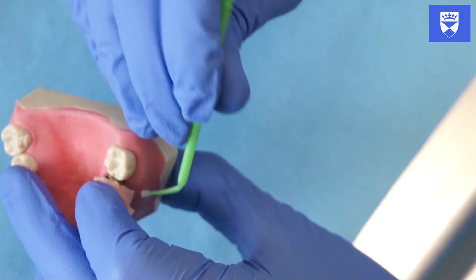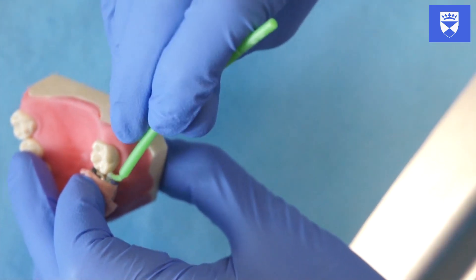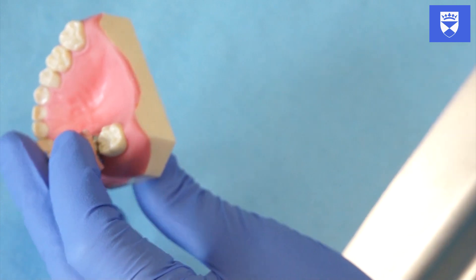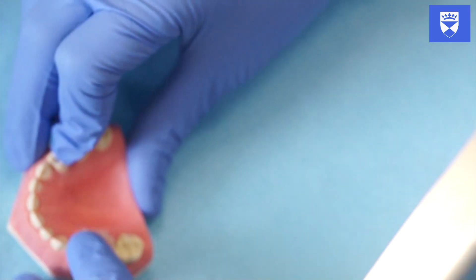Once the crown has been well seated using either of these methods, ask the patient to open their mouth. Wipe away any excess cement with a cotton wool roll, micro brush, or a piece of gauze.